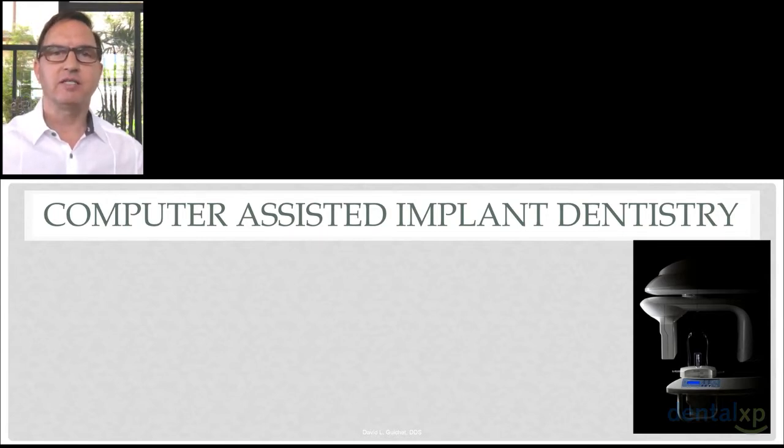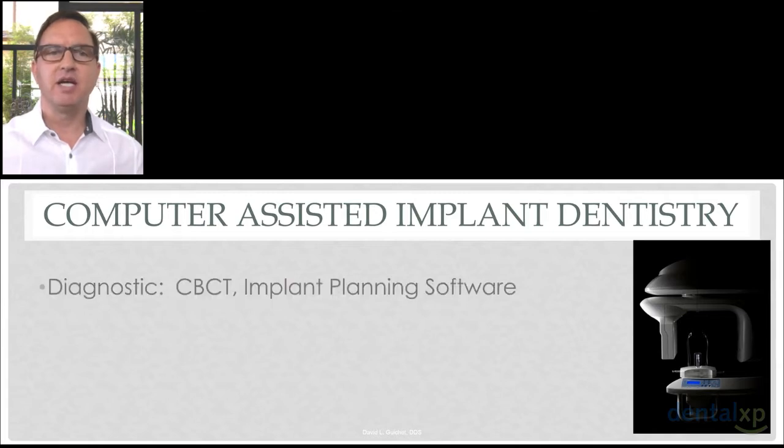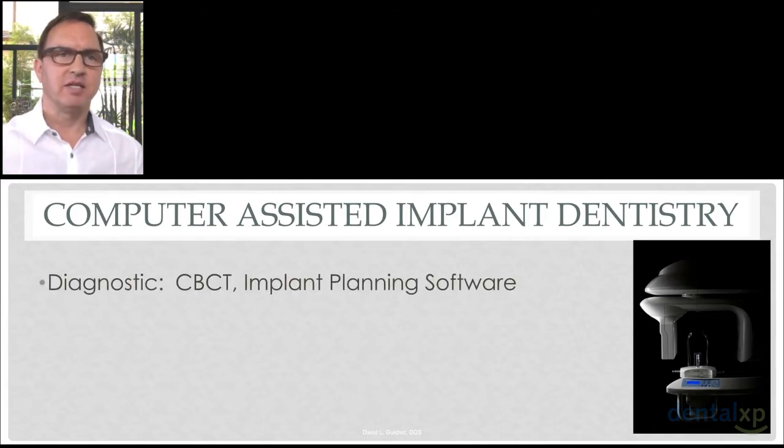Now, we utilize computers in implant dentistry in a variety of ways. Digitally, we use them for diagnosis. A cone beam CT is an excellent import area to start the digital workflow. We also, in some instances, go beyond utilizing CBCT and use implant treatment planning software such as Implant.